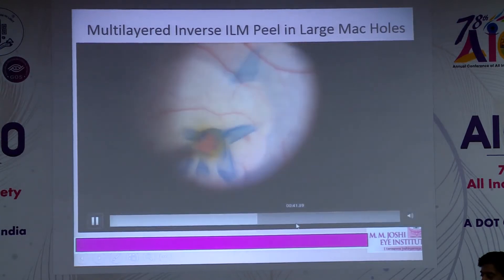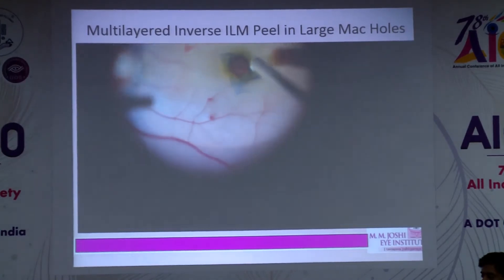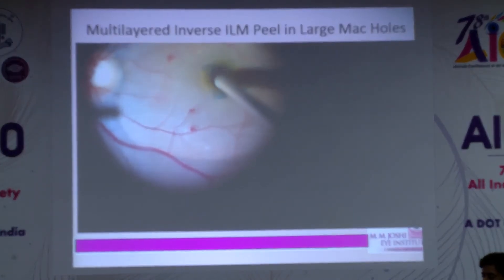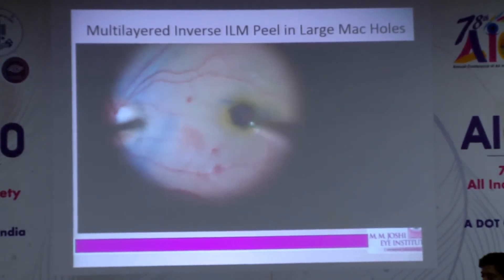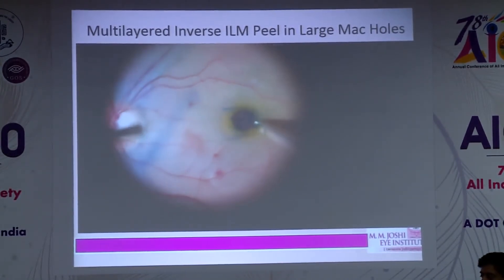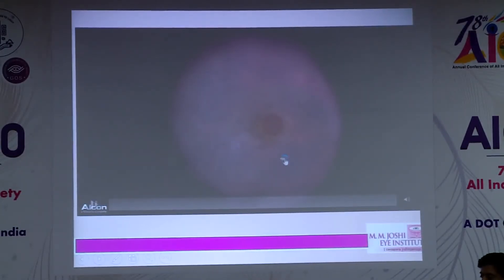Here I'm completing the peel. In my first 10 cases I found a small mound-like protrusion, so I trimmed the flaps when they were too long. After about 15 such surgeries, I started doing this technique under PFO.